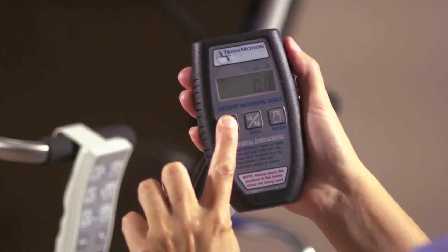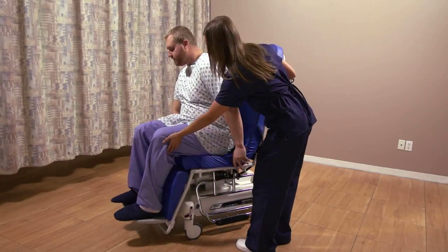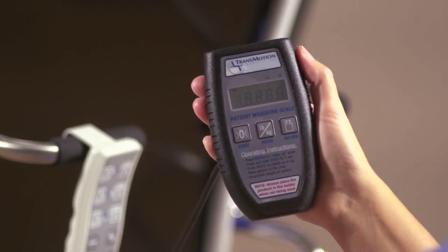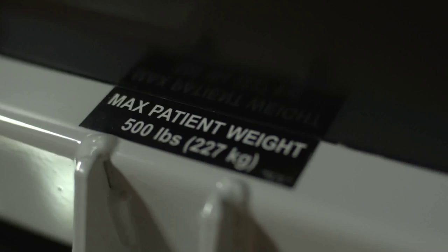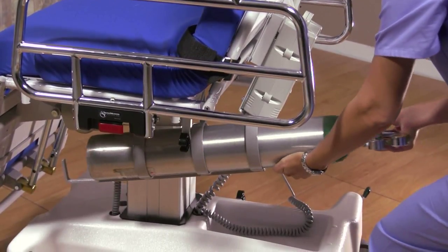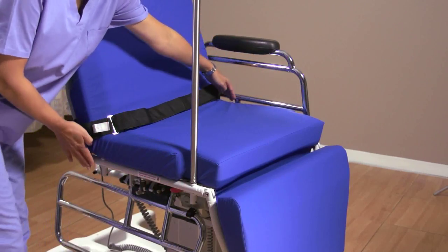To use the scale, push the zero button for three seconds to clear it. Then place the patient onto the chair in the upright position, select pounds or kilograms, press the weigh button, and the patient weight will display. After 60 seconds, the display will time out. Your chair might also have accessories like an oxygen tank holder mounted on the chair, and an IV pole which can mount in any of the four wells located at the corners of the seat section. TransMotion Medical offers over 50 options and accessories, making this versatile stretcher chair an excellent choice for your facility.